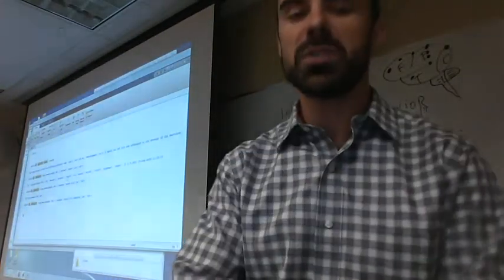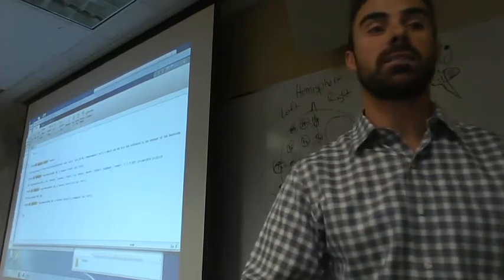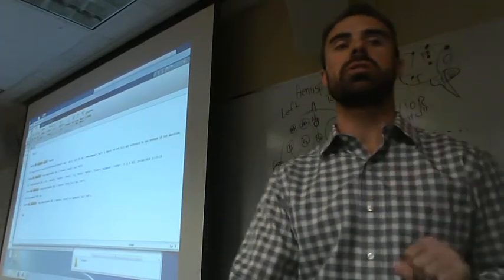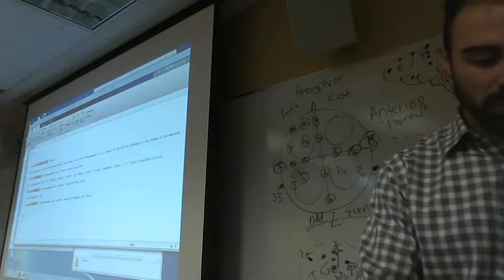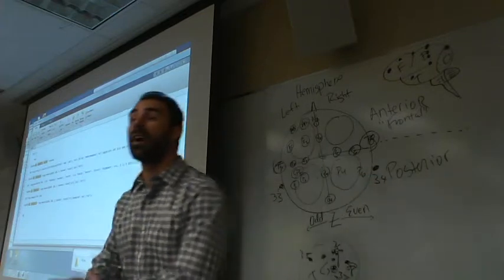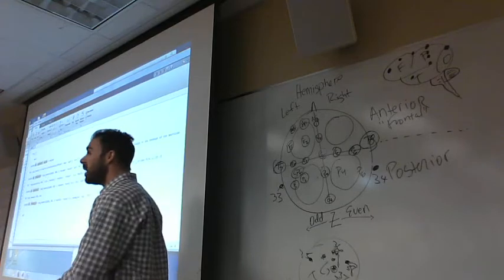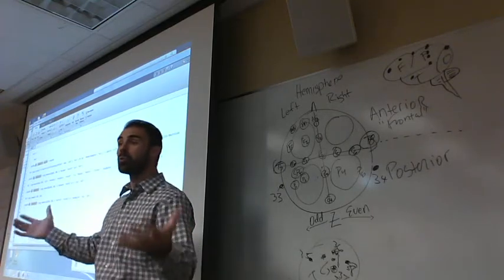Whatever we want it to, which means we need to define it, don't we? Okay, let's define subj. To do that, go underneath 5 through 17 and type the word subj. Let's give the computer a command and instruct it. Do you remember our first day we said C equals 5 and B equals 10, and we were able to add C plus B, and MATLAB automatically knew? So we're doing that now.